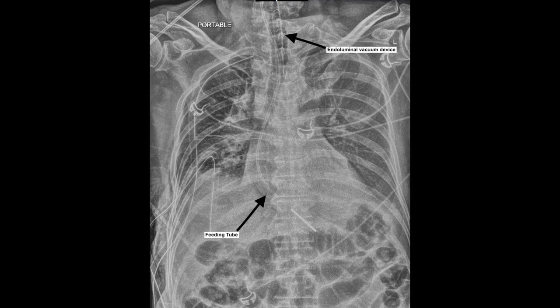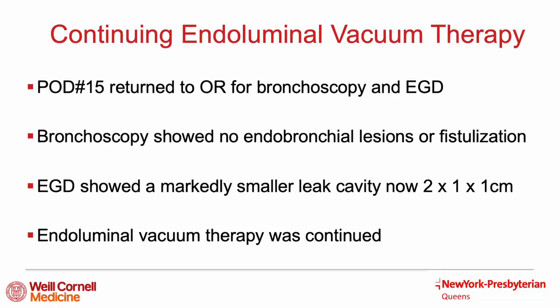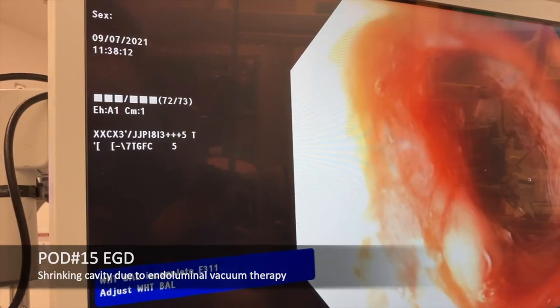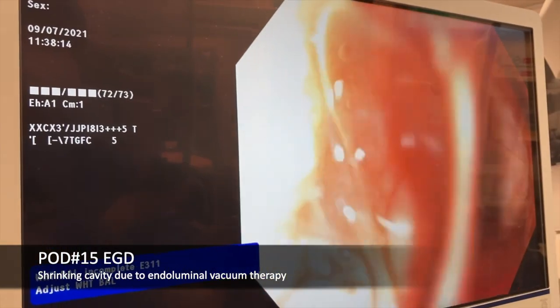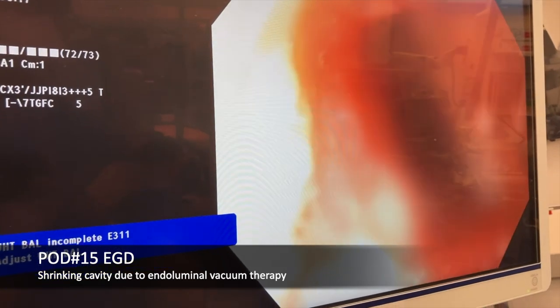Serial chest x-rays were used to confirm placement of the sponge between serial endoscopies. Here we can see both the endoluminal device and feeding tube remain in appropriate position. On postoperative day 15, the patient returned to the operating room for bronchoscopy, which showed no fistular communication between the esophagus and bronchus. The repeat endoscopy showed a markedly smaller cavity, now 2 by 1 by 1 centimeter, and endoluminal vacuum therapy was continued. Here is the repeat endoscopy showing rapid improvement of the cavity over just 4 days with endoluminal vacuum therapy.